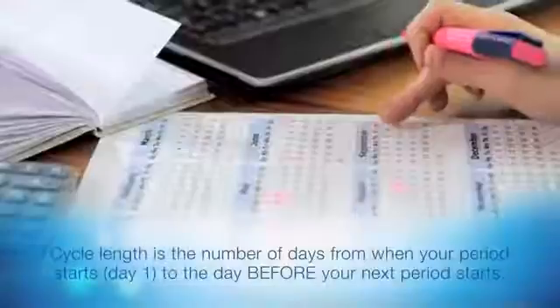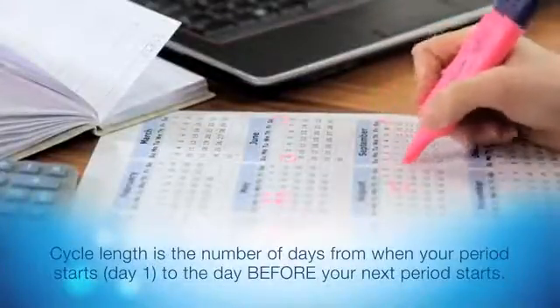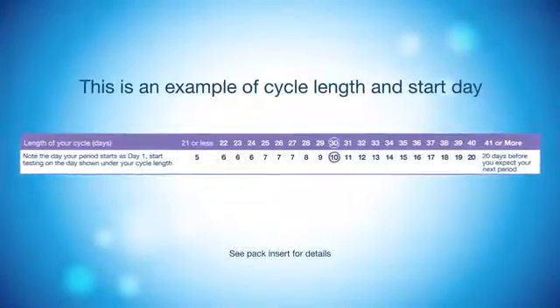You need to know your cycle length before you start testing. This is the number of days from the day your period starts to the day before your next period starts. The table in the pack insert will tell you which day of your cycle to start testing, depending on your cycle length.